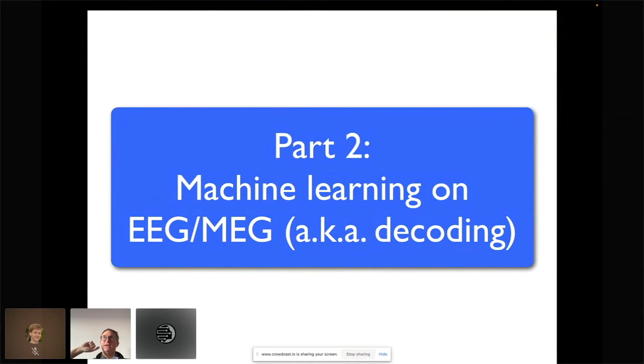The question is, what should you do? My answer is that on any processing pipeline, and people may object to this, do your entire processing pipeline with very little pre-processing and very little data cleaning, and go to the end of, let's say, an effect that should be there in your data. If you do auditory studies, just do a full experiment, a full processing pipeline, until you see evoked components of auditory activations. This is the thing that must be in your data set.